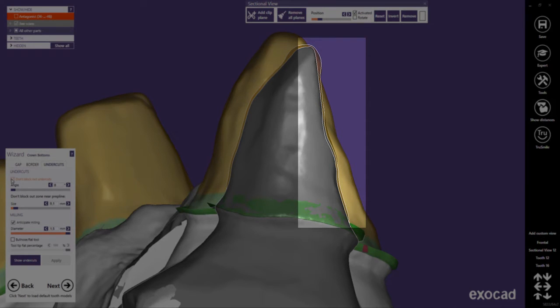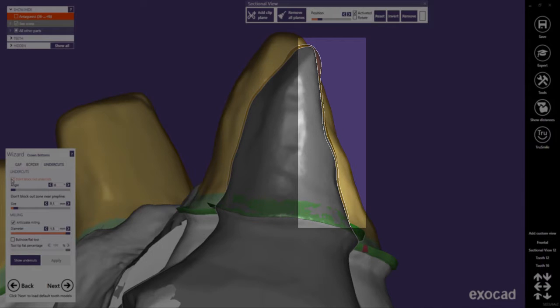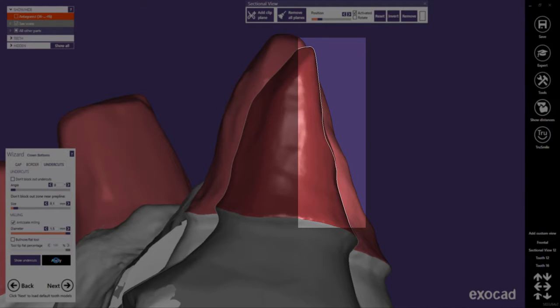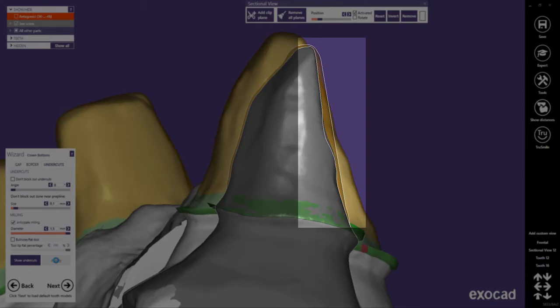Now you see that undercuts are not blocked out. Let's again look at the preparation when undercuts are blocked out. Here is the default situation with blocked out undercuts.